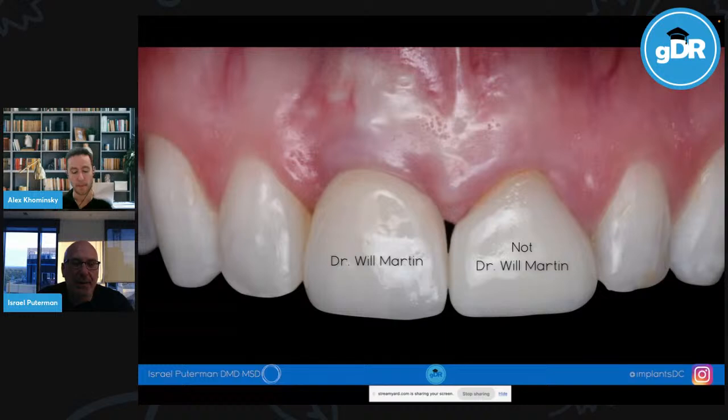And which patients do I make a surgical guide for? I don't use guided surgery on every implant. I use guided surgery on every anterior implant, and anterior is defined as roughly first premolar to first premolar. Sometimes I won't on a first premolar, and sometimes I will. Canine to canine, exclusively, only guided. And anything in the posterior that's more than 2 implants, I'll place a premolar and a molar side by side without using guided, though sometimes I will if space is tight.